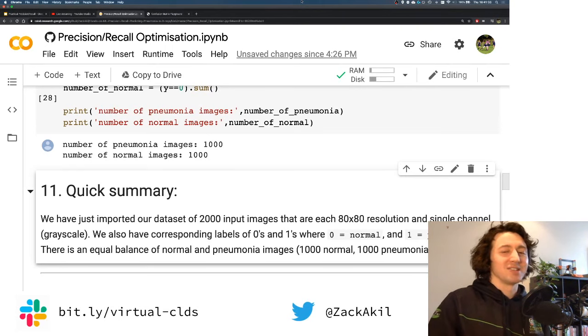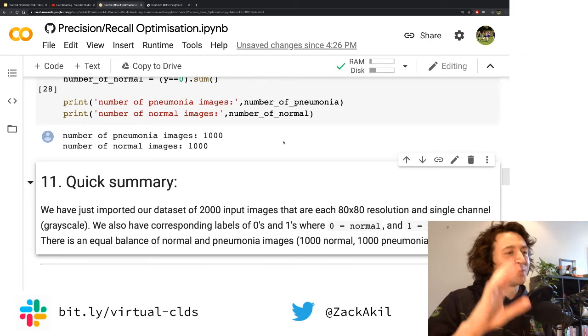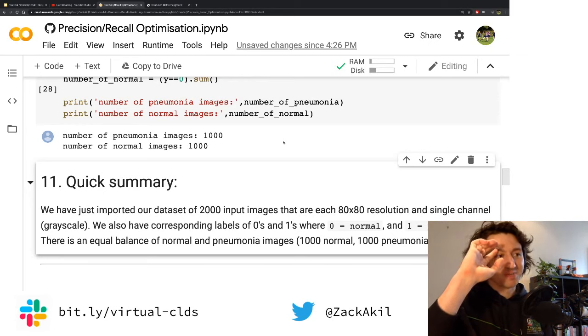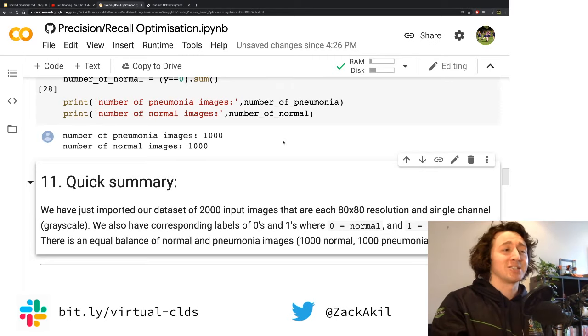That is surprisingly rare in the real world. You rarely get a data set that is perfectly balanced. If you remember at the start, the very first time I introduced what training data and test data are, I showed an accuracy score, which was just the percentage of correct predictions.